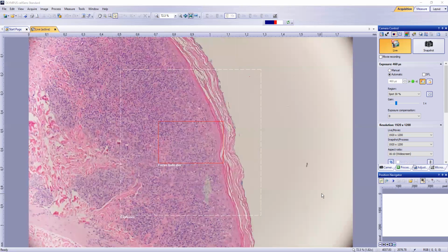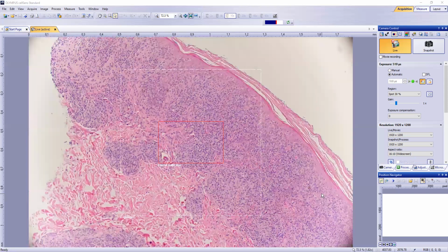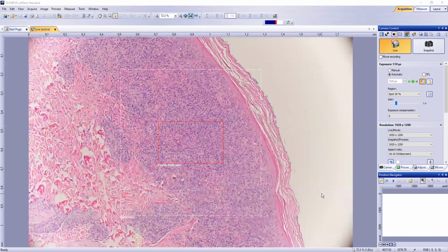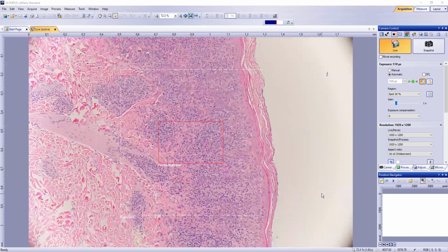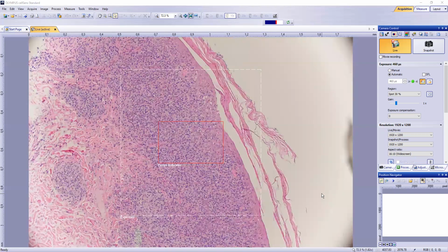In some areas, it's still retaining that basket weave to slightly compact stratum corneum. The other thing you'll see is that the granular layer is not obvious. In fact, we have hypogranulosis. You don't have wedge-shaped hypergranulosis in cutaneous syphilis.